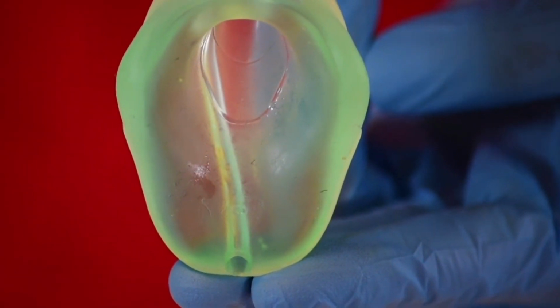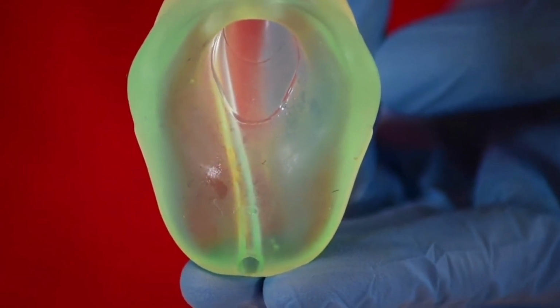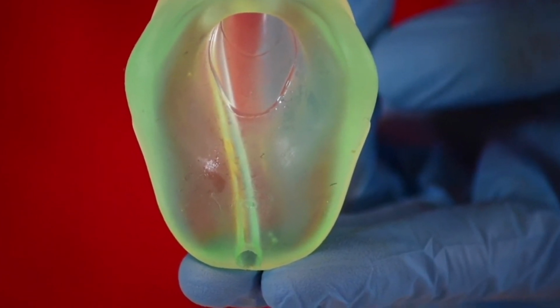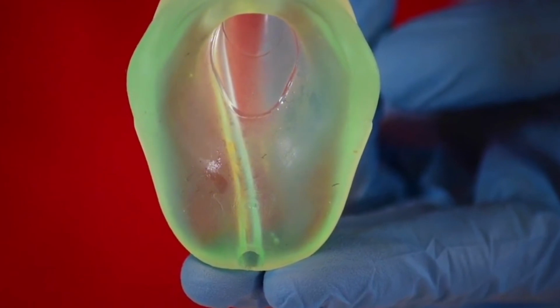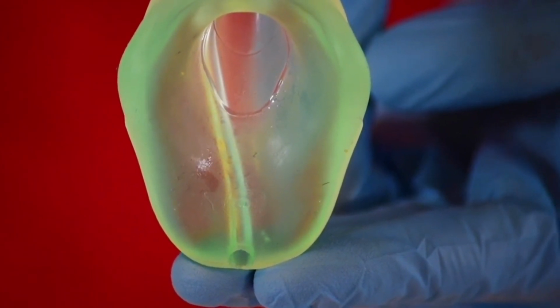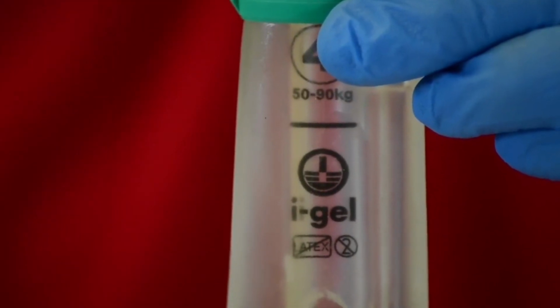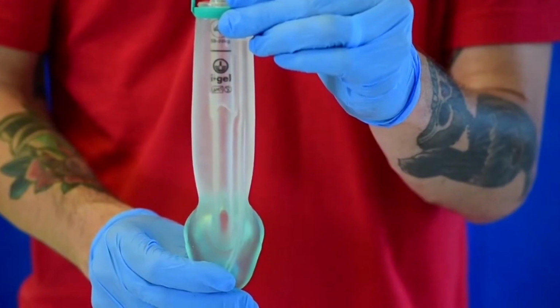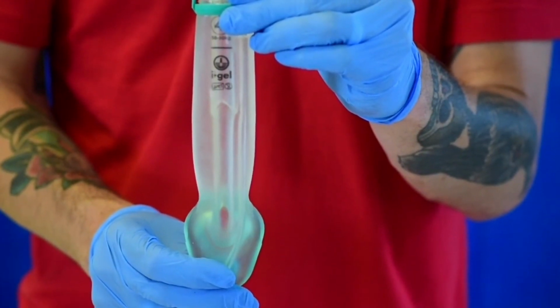The device has a gel-filled cuff that sits over the laryngeal inlet. The gel in the device changes its shape as the device warms up once inserted into the airway. This feature means that a small leak should improve after a few minutes of use as the device conforms to the anatomy. Above the cuff, the device has a bite block so the patients cannot obstruct the airway by biting. A black line indicates the maximum depth of insertion. The top of the device connects to the bag valve device once the mask is removed.